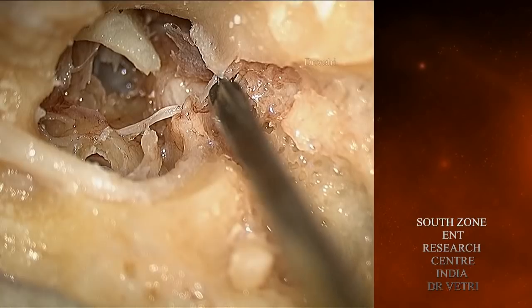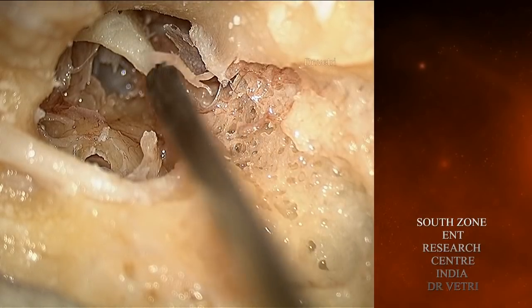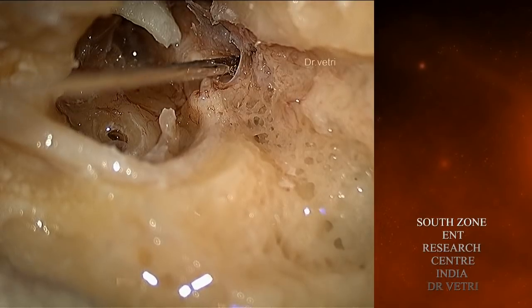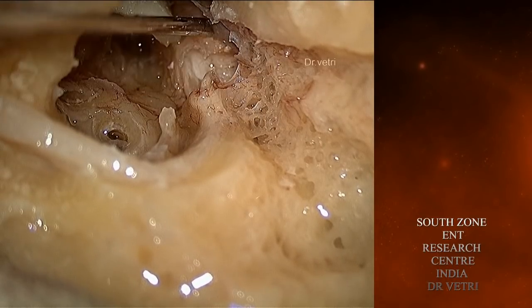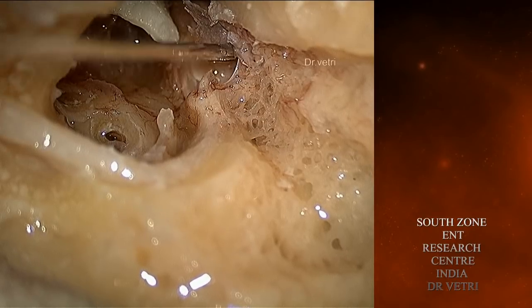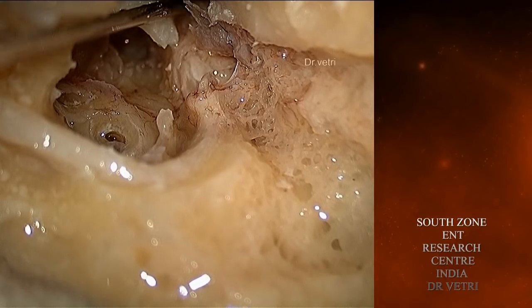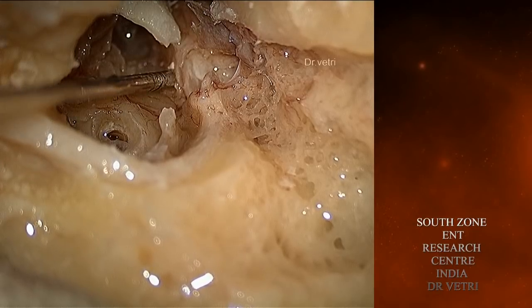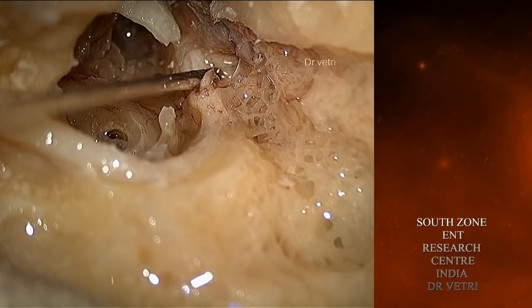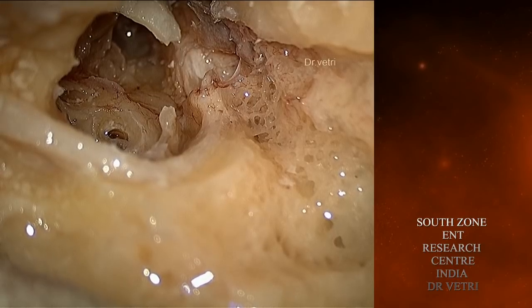The head of the malleus is now being removed. You can see the beautiful appearance of the chorda tympani. The anterior outer attic wall. The chorda tympani has been removed. You are seeing the tensor fold and the supratubal recess — that is the common seat of cholesteatoma.